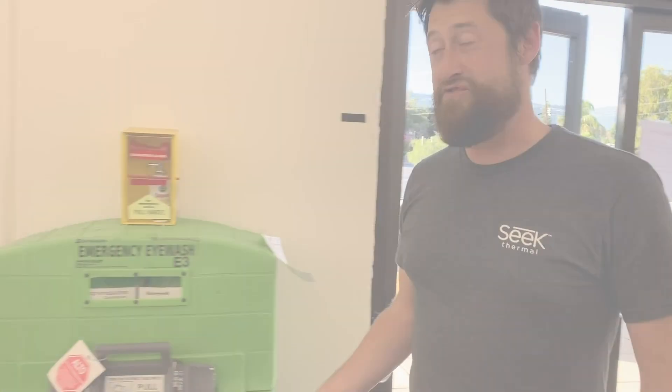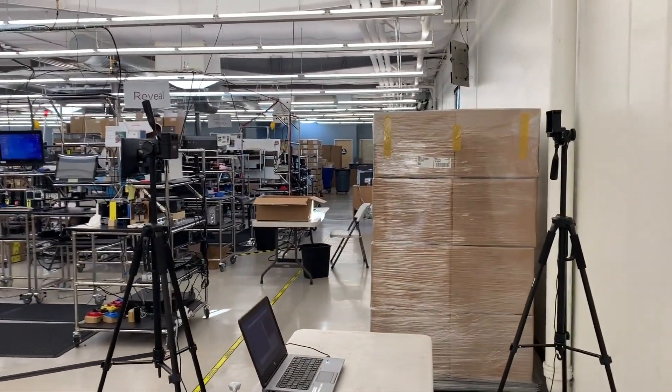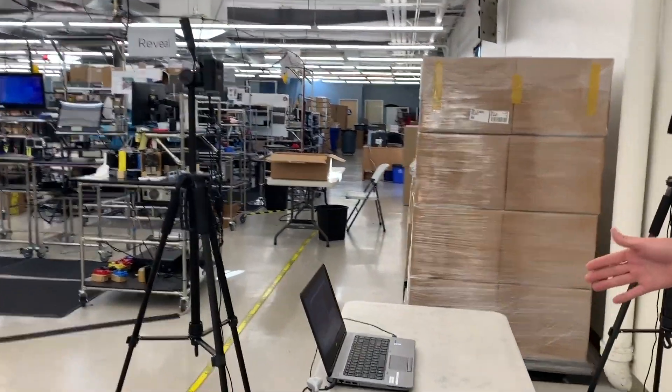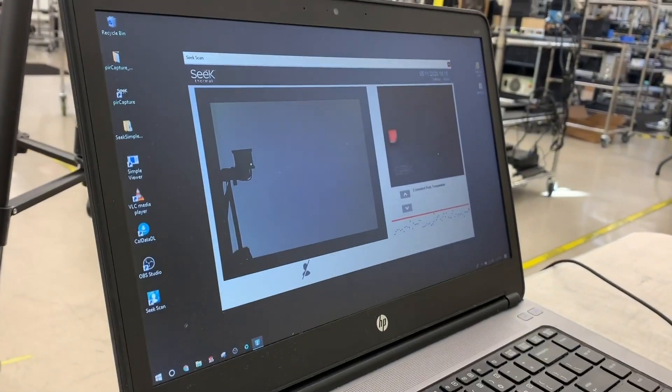Now we're at the back entrance to our facility. This is where our manufacturing plant is. We have a secondary setup here set up on tripods. You can see we have a nice indication about where people are supposed to stand and look at the camera. We also have a monitor displayed so that the person can monitor themselves.